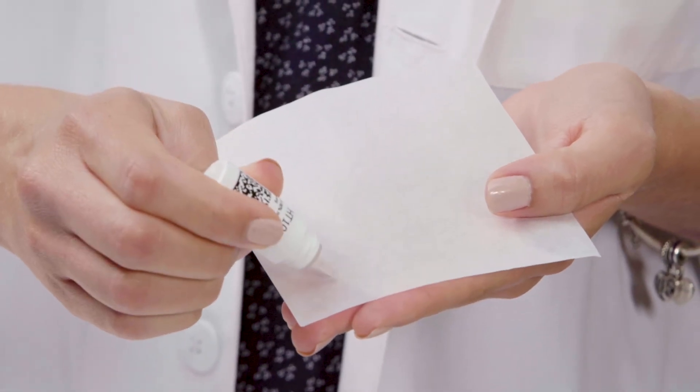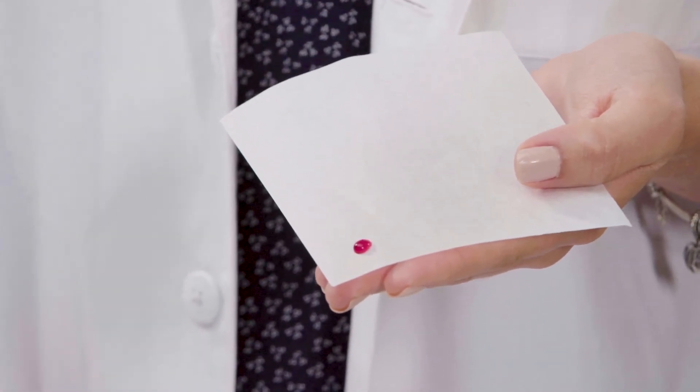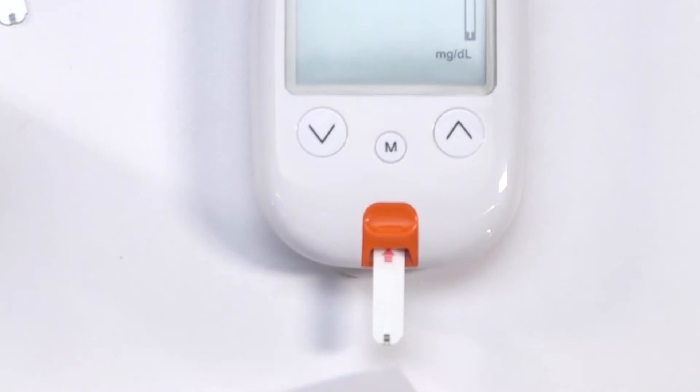Take your solution and discard the first drop. Squeeze a small amount onto a clean, non-absorbent surface like wax paper — not directly onto the test strip, as contamination may occur. Introduce the tip of the test strip to the solution drop.